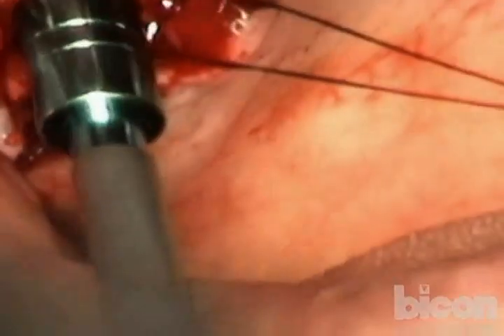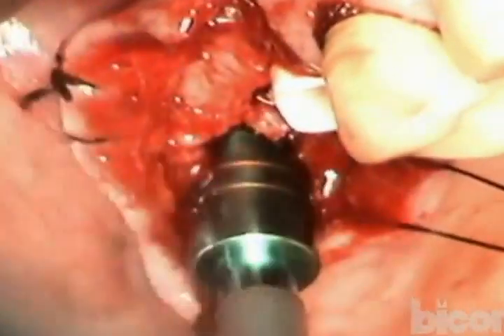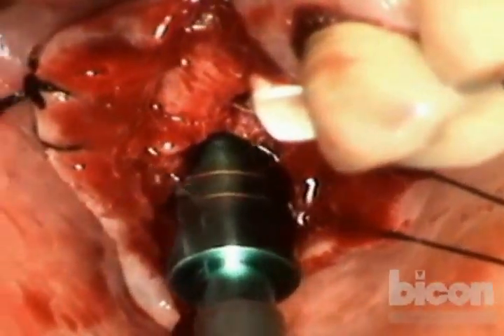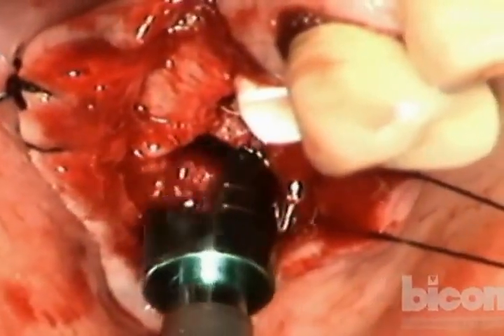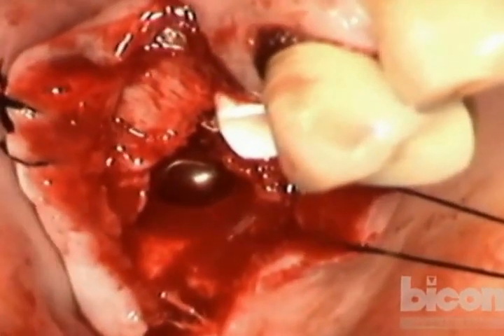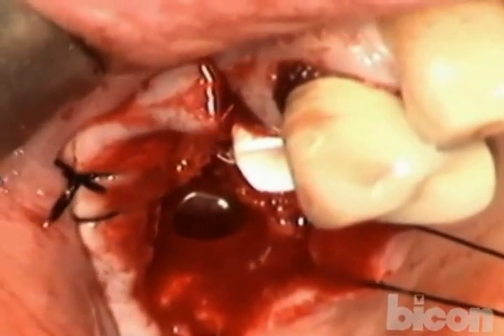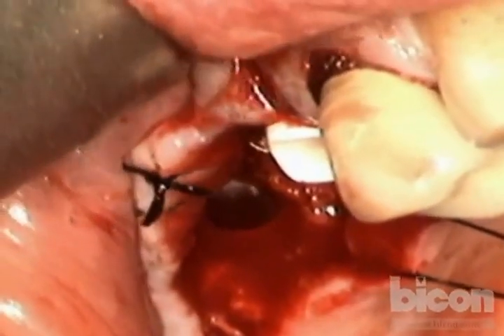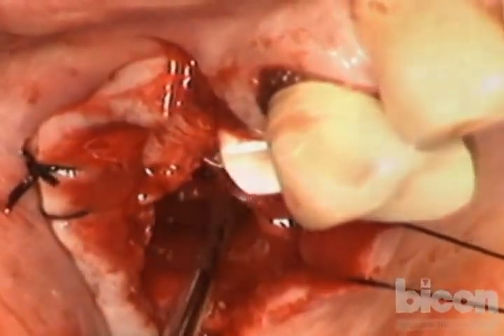Turn slightly to the left. Good. And move the camera. Okay, don't suction there. Don't suction there. Okay, we're almost there. Just a few more taps and then I will put the implants in. I'll take a 5x6 and a 6x5.7. I will also take the graft now.